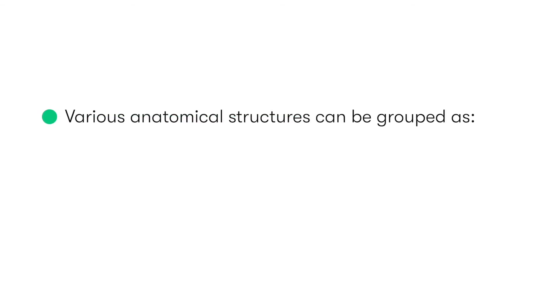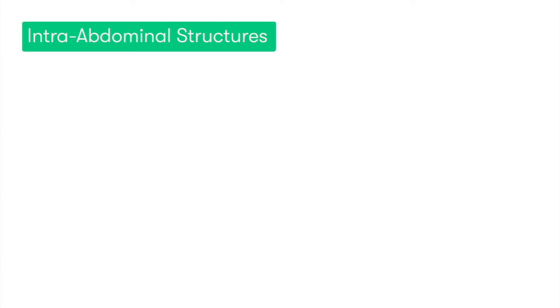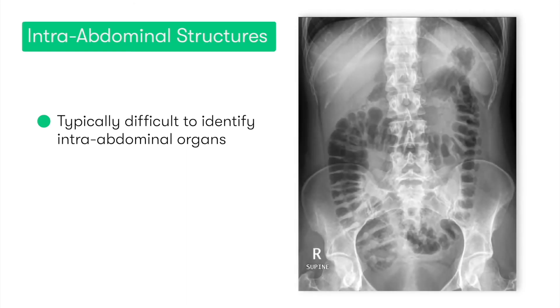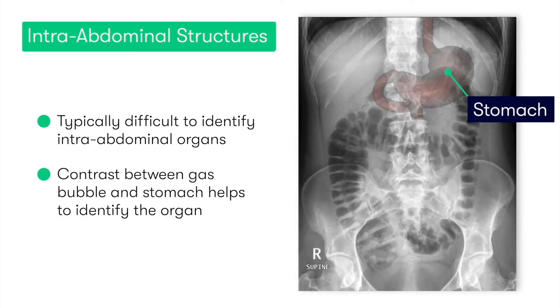We can group the various anatomical structures based on whether they lie inside the abdominal cavity or outside of it. Starting with intra-abdominal organs: in a normal abdo x-ray, it can be quite difficult to visualize intra-abdominal organs. However, as you can see here, the stomach can usually be identified due to the presence of a gas bubble, and the clear distinction between it and the fluid content within the stomach itself.